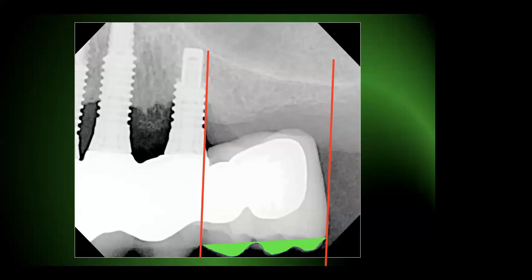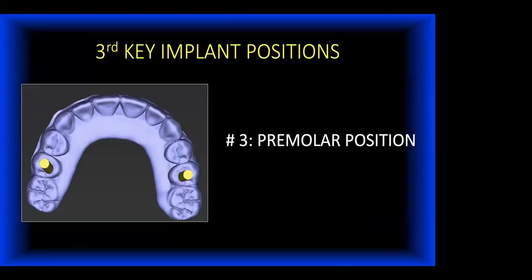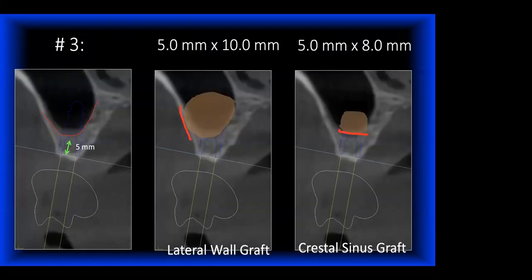Not a good situation. So one of the key criteria for minimizing maxillary prosthesis failure is to minimize the cantilever effect. And also, in cases where we have significant parafunction or more force needed, we want one in the premolar area. Usually this is the second premolar, the further posterior, the greater counteraction of the force. But if the bone isn't of quality or quantity in that area, you can put them in the first premolar.